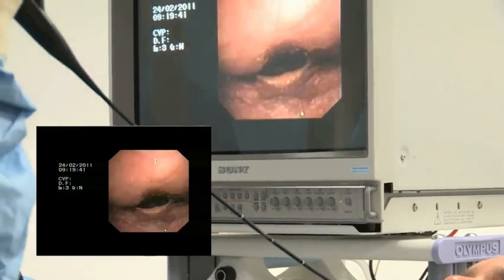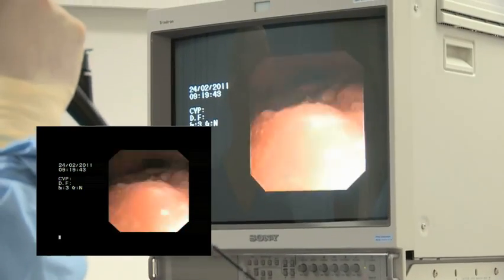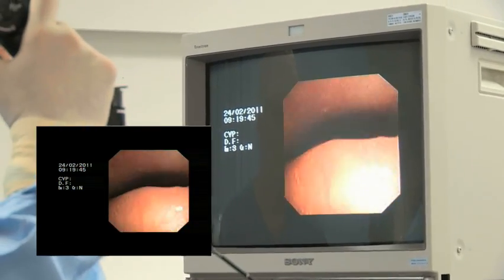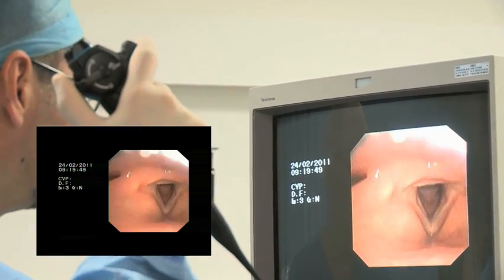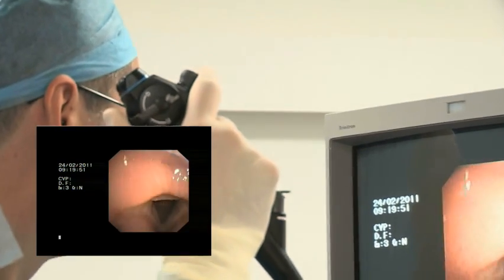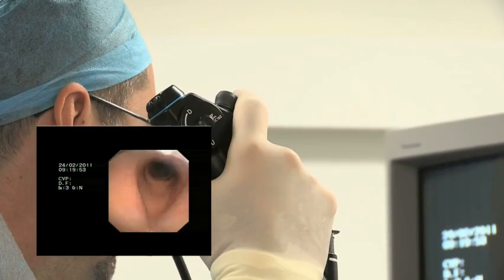It is essential to supply oxygen at all times to patients wherever possible. We do not recommend insufflating oxygen down the suction channel of the scope. There are case reports of this leading to gastric injury.